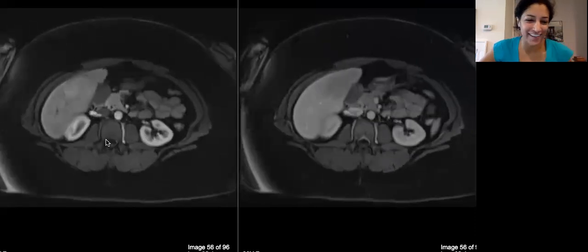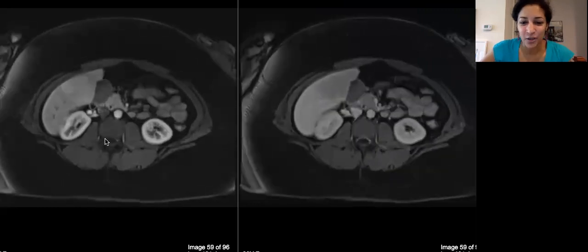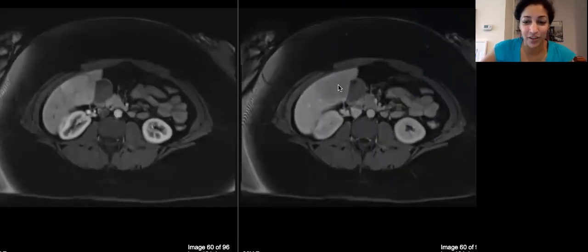Yeah, so Susan Asher has got it. So it says, yes, and Anu also. So FNH can have fat. So this ended up getting resected because it was called, potentially an adenoma because of the fat.